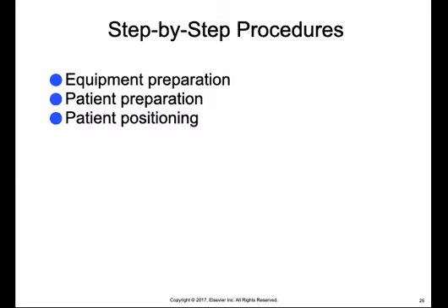Some step-by-step procedures include equipment preparation, patient preparation, and patient positioning. And just a note, to remind you all that before exposing a panoramic receptor, infection control procedures must be adhered to.